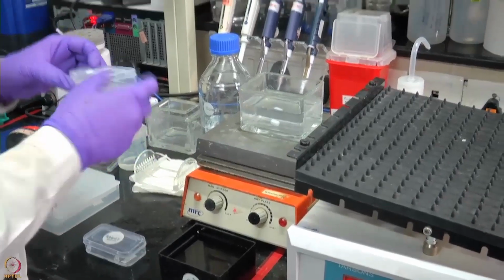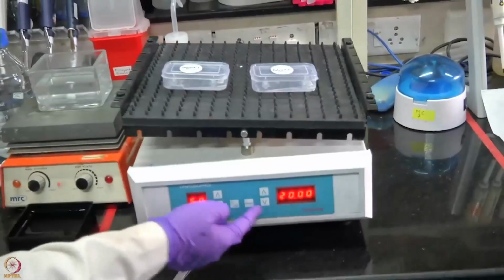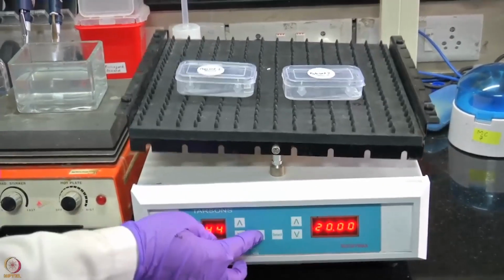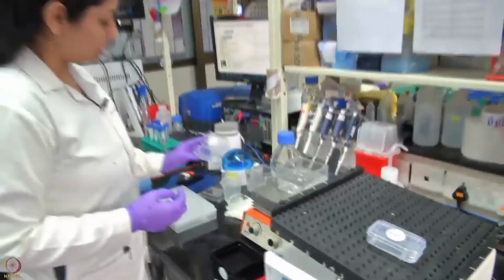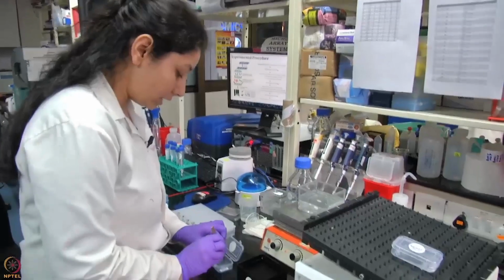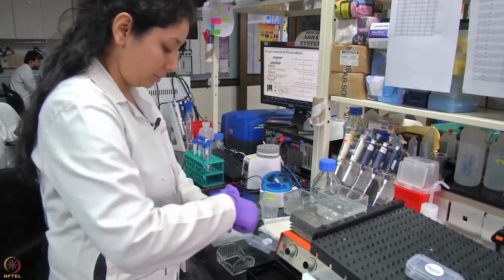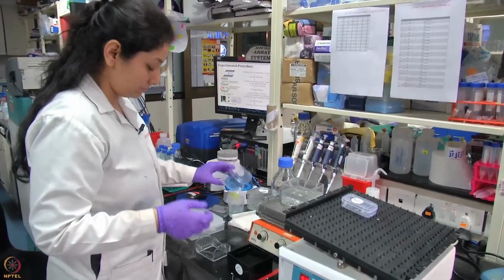Now again, this slide is incubated with this human sera and anti-GST antibody for 2 hours on the rocker. Once the incubation is performed for 2 hours, we decant the serum sample. Make sure that the slide is kept properly and we do not disturb it. Now we take the slide out and put it back in the cassette. The same procedure is repeated for the second sample.